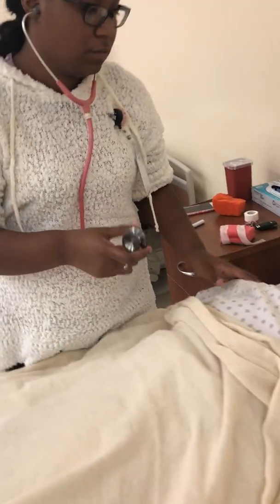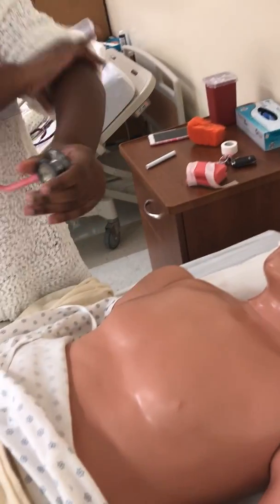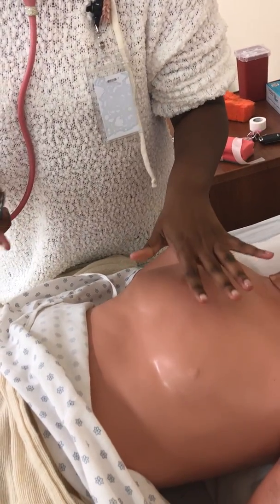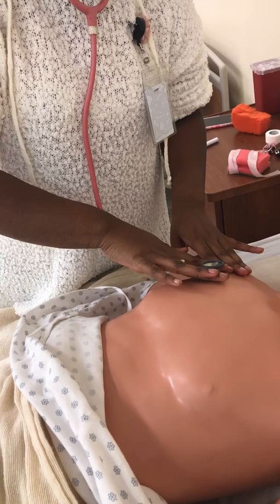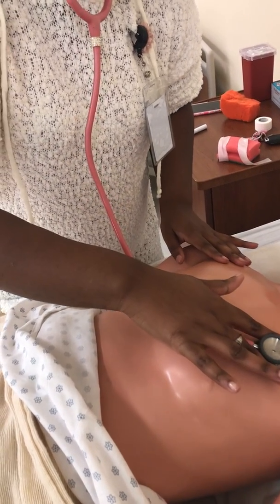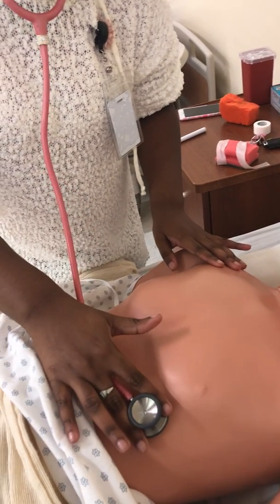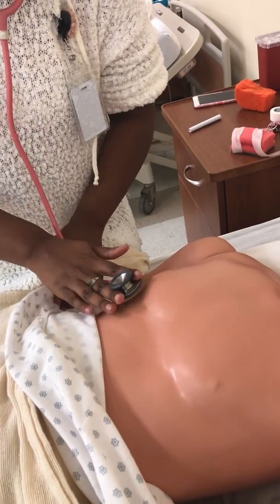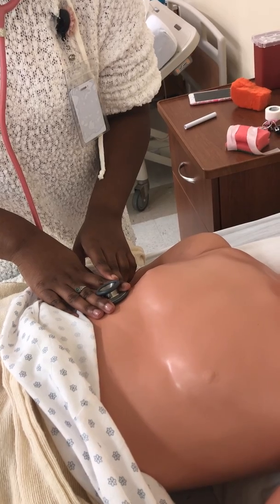Starting off, I'm going to listen 6 times here because the right side has 3 lobes and the left side has 2. I'm going to start here and listen at the top lobe. Then I'm going symmetrically over here to the left. Now I'm going to the mid lobe. Now I'm going symmetrically over here to the mid lobe.